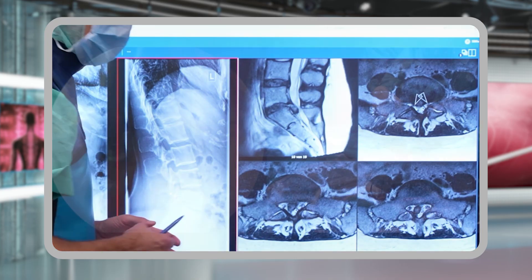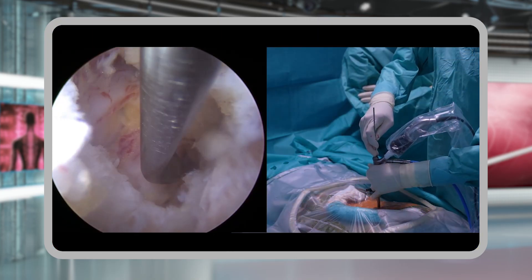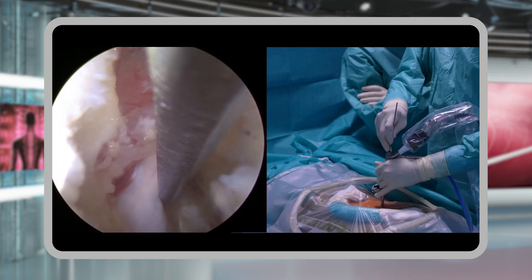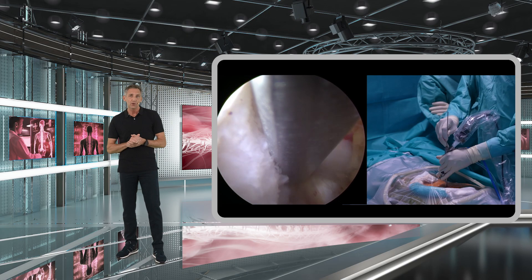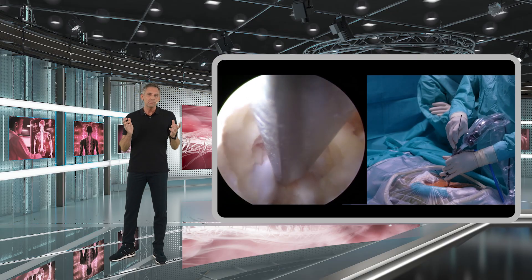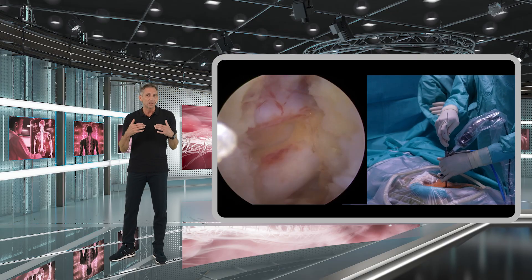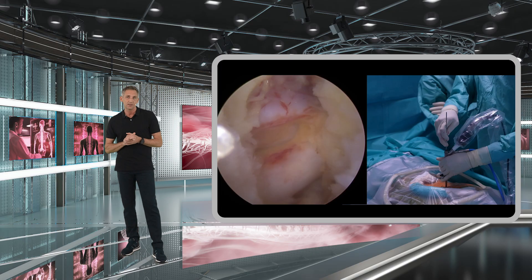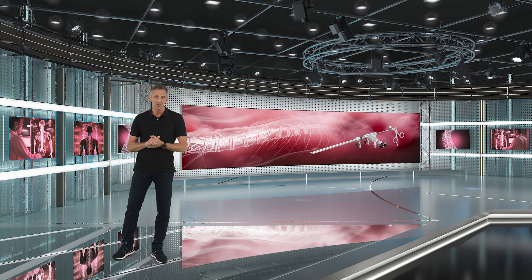In case you have a sequester located in the axilla of the nerve root, you should first try to grasp it and mobilize it from lateral of the nerve root, simply because it's much easier and you may be able to retrieve many of these axilla disc herniations this way.